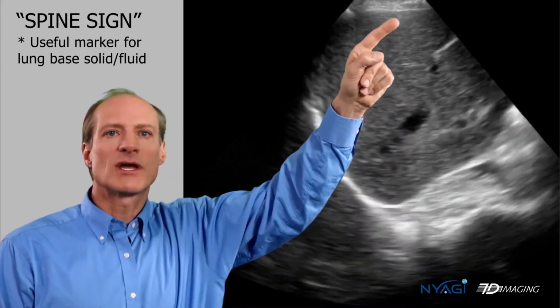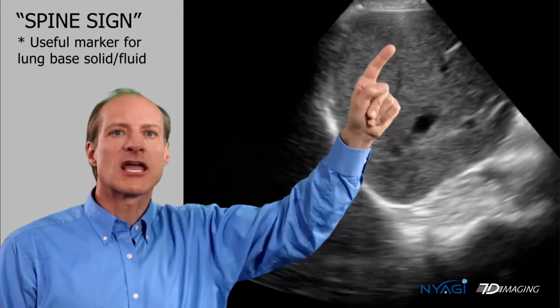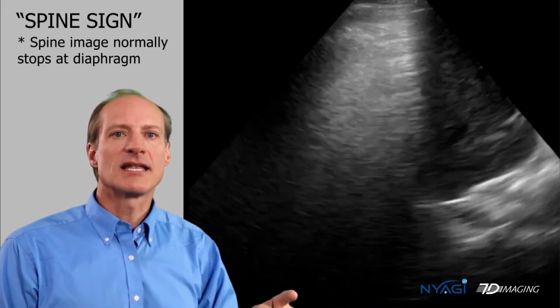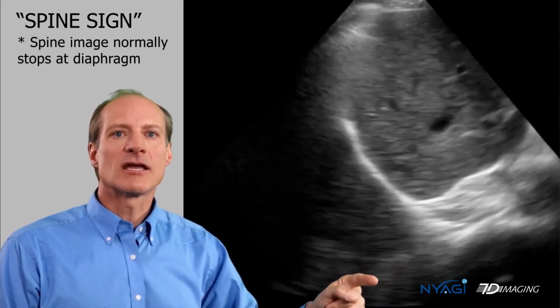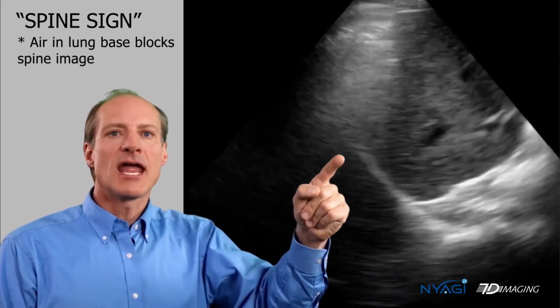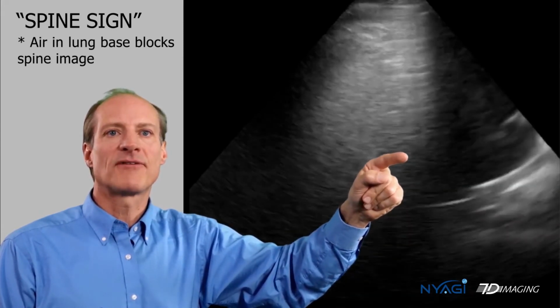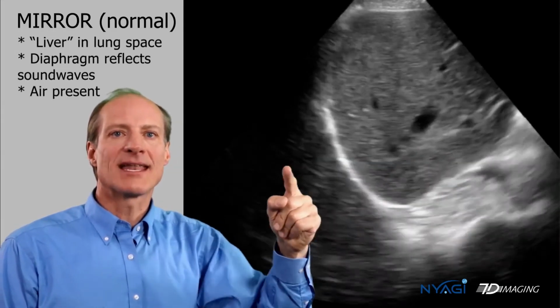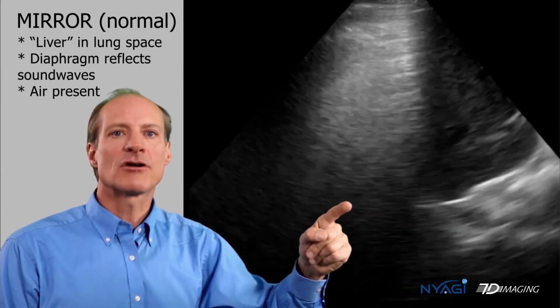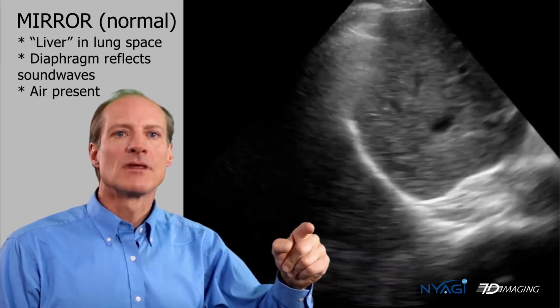This is normal because the sound waves travel through the fluid of the liver and reflect the spine image back up to the probe. Notice that the spine does not extend above the diaphragm. That's because in this image, the lung at the base is filled with air. Air does not transmit sound waves well, so the signal will come down, reflect off of the diaphragm, make a couple of bounces, then go back up to the probe and record it. That long distance will recreate an image of the liver superior or above the diaphragm. That's normal. It's called a mirror artifact.